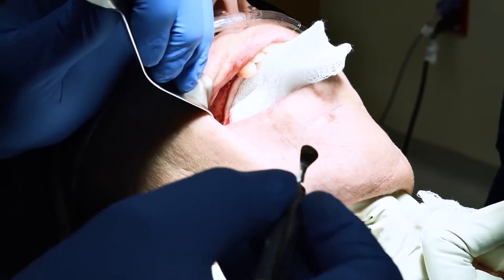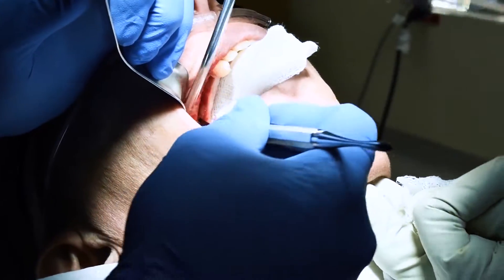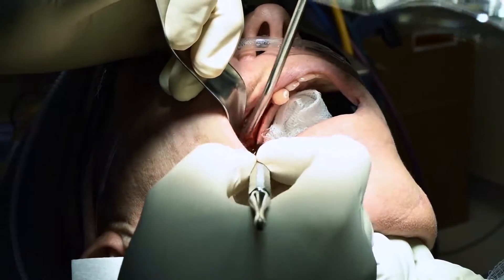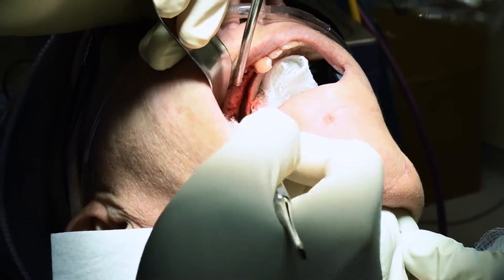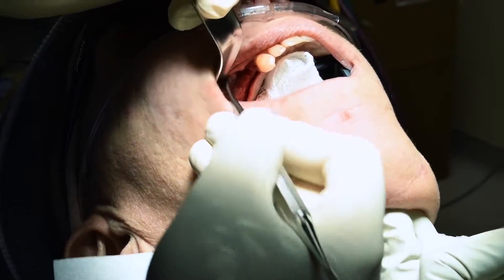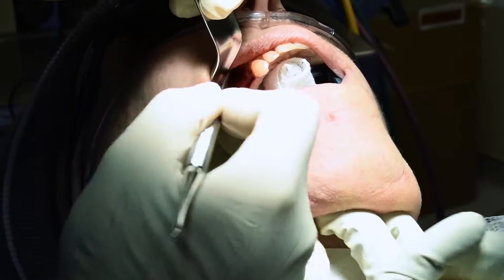Good riddance. I wonder if it's like — is that from the plate? I think she had a load of something sitting there. It's making infection or something. Chromogenic bacteria. Oh yeah, so was that infection from the plate though? It's not infection necessarily. I'm not really too sure what the heck that was.